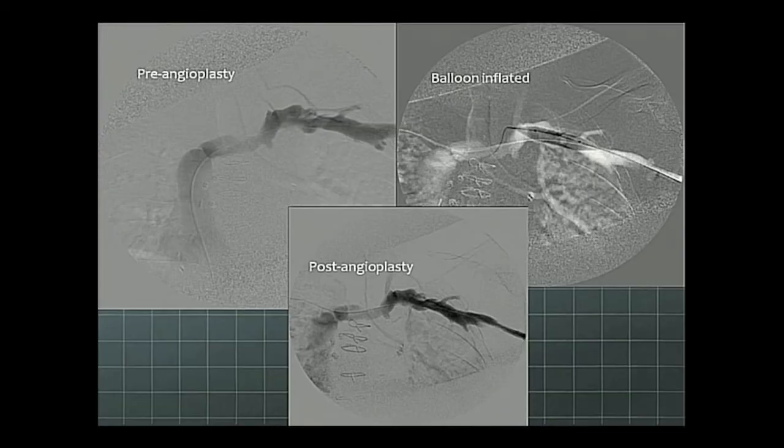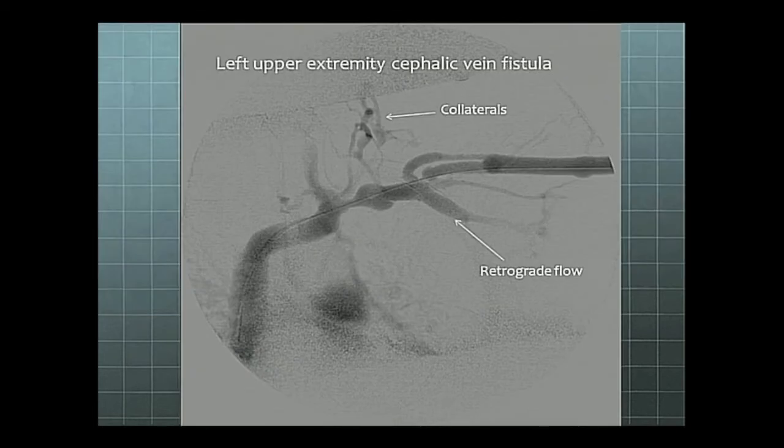Well, what do we know about valves when we dilate them elsewhere? This is a dialysis patient with a graft down the forearm here, with some signs of venous stenosis. There's some other disease as well, but I saw this. Here's a valve in the subclavian, and this jet remained constant. I think it's probably due to valves that are fixed. I dilated this, and there's no waist, and when I take the balloon down, it looks exactly the same. That's generally been my experience when you try to dilate valves. They really don't respond well to angioplasty.